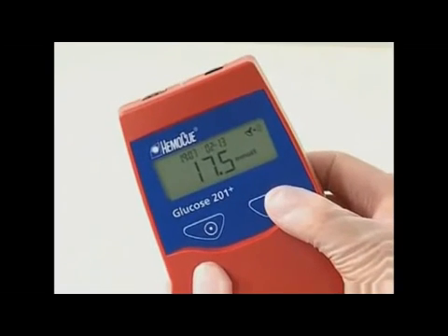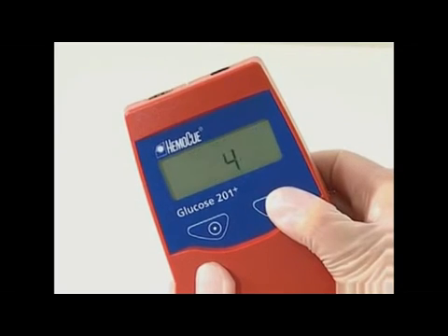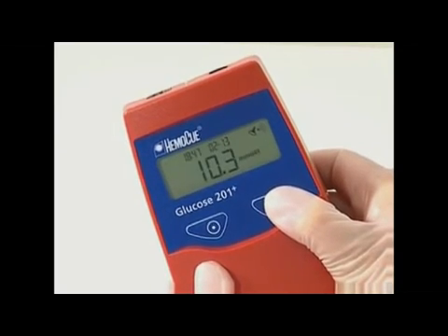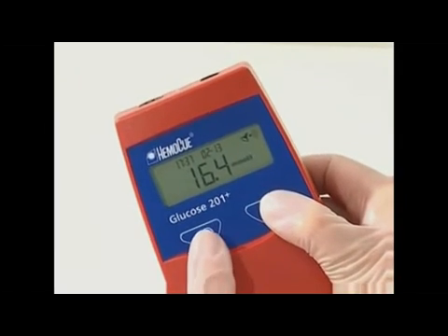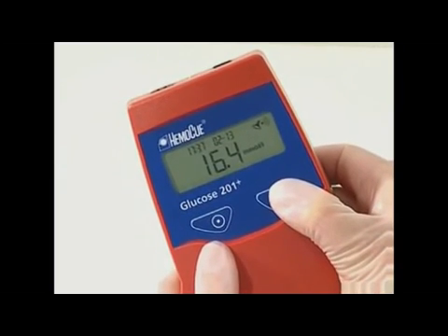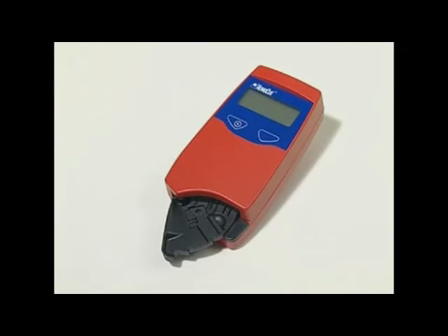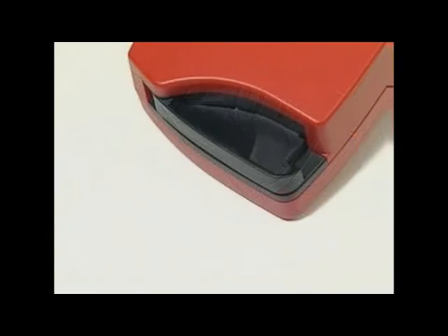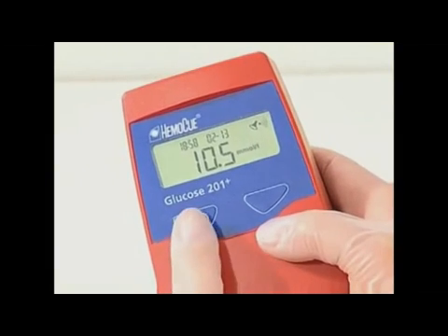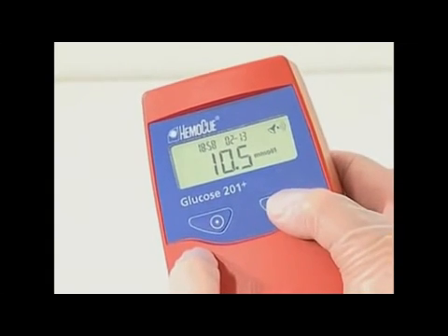The analyzer automatically stores up to 600 results. When the memory is full, the analyzer will automatically overwrite the oldest result. To view results stored in the memory, use the following procedure. The cuvette holder may be in the loading position or in the measuring position. If in the measuring position, the most recent measurement is displayed.